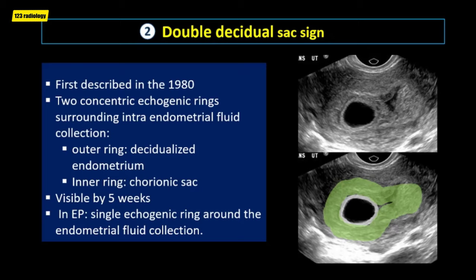The outer ring is the decidualized endometrium, while the inner ring is the chorionic sac. It is seen at 5 weeks of gestation by transvaginal ultrasound. Conversely, in ectopic pregnancy, the decidual reaction presents only a single echogenic ring around the endometrial fluid collection.